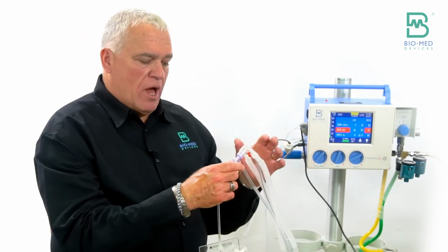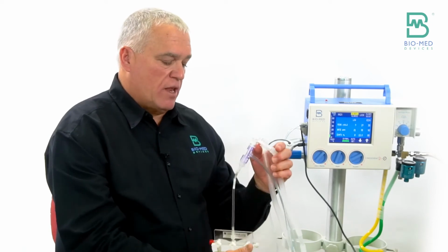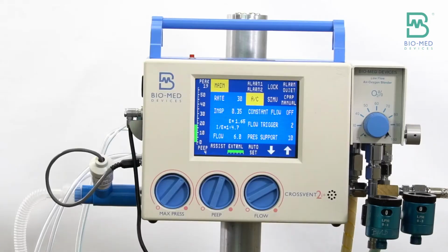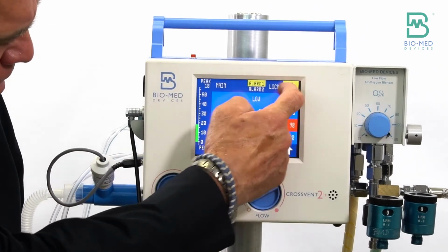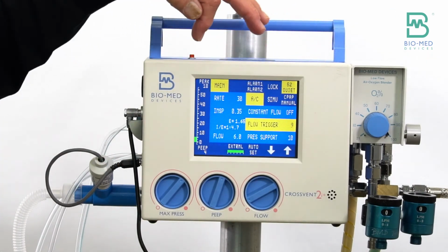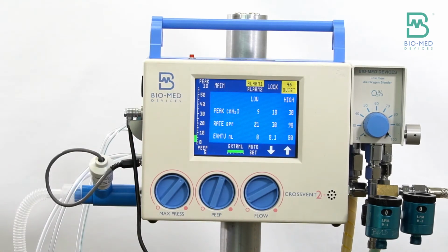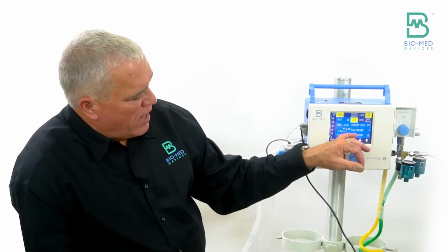So the bottom line is, even with a high dollar ICU vent, anytime you have a leak around the ET tube, you really don't know what the patient's getting. So in our case, before I turned on that leak I was getting 14, and if I have to dial this flow up to 9, let's take a look at what our volumes are. Instead of 14, I'm only getting 8.